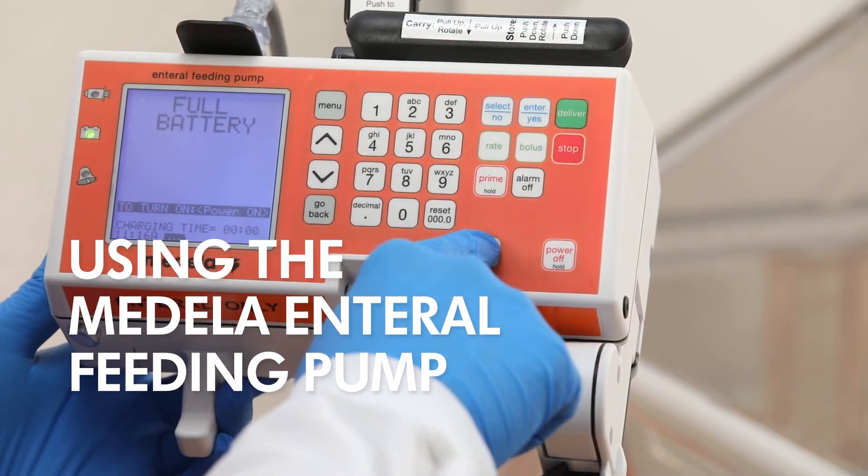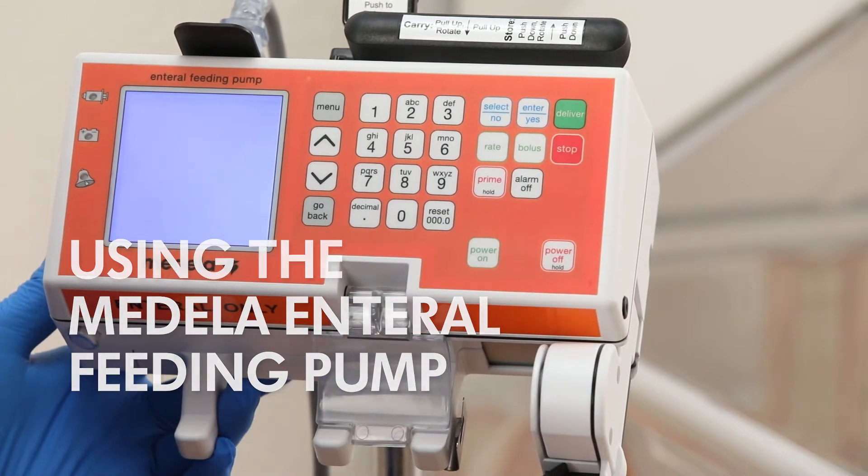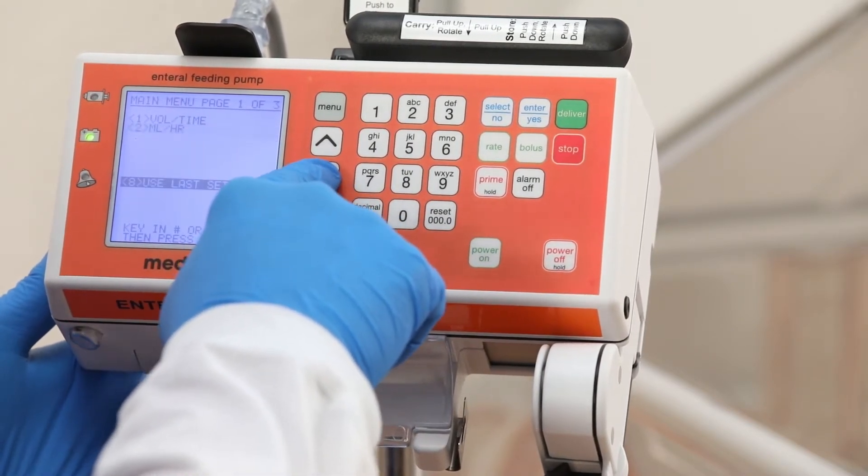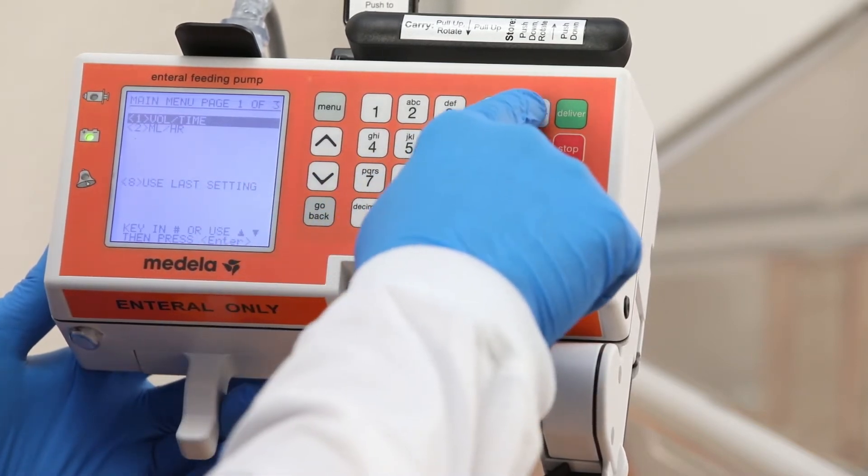To turn the pump on, press the power on key. Use the arrow keys to select volume over time, milliliters per hour, or use last setting, then press the enter/yes key.